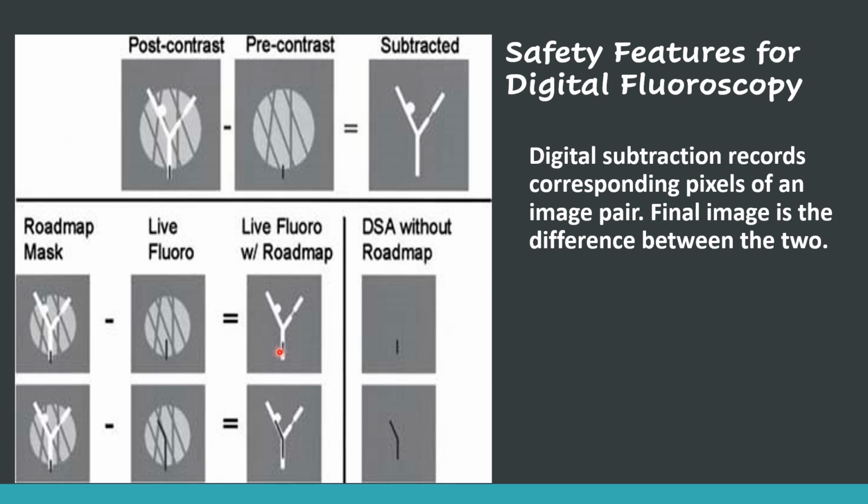So we can actually hold this static image here and then just thread the catheter. It's where we can just use live fluoro to see the stent or the needle that needs to go in with another image that's laid on top of it right here. So we can have a residual image or an overlapped image of the contrast so we can see where this is going.